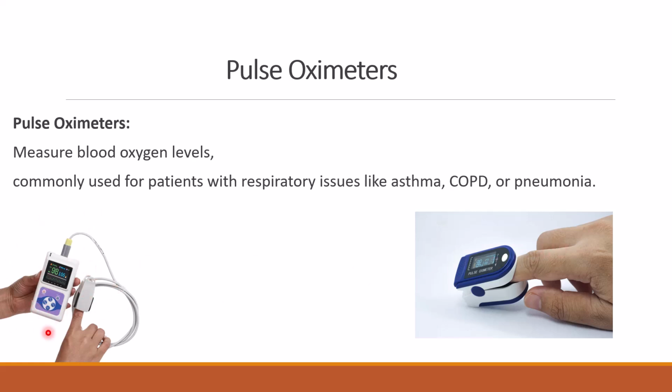And here we can record the readings of the patients, and we can make a graph. We have more options compared to this one. This one is very simple, and its accuracy is less than this one. We have another one which is used in ICUs, like a separate device. The main unit will be bigger, and we will put it on a stand. Sometimes we use it in home care, but the two most common types are the fingertip for simple cases, and this one for the more sophisticated cases.